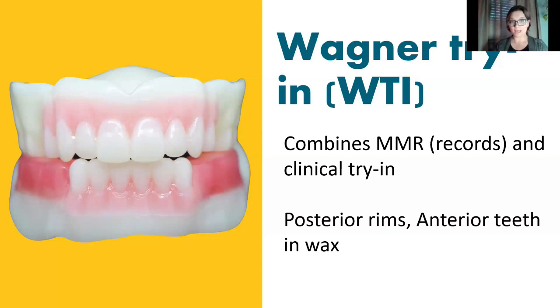They can set the midline, set the incisal edge, set the gingival margin with those teeth. But then they get to also do the MMR appointment. So now they can adjust the vertical dimension, establish CR using centric relation, the same way that we normally do with our conventional dentures. So the clinicians, the faculty, didn't have to learn anything really new. They just get to take this next step towards digital dentures. I call this the gateway denture, because it's a really nice workflow for clinicians that are comfortable with conventional, but want some of the benefits of digital.